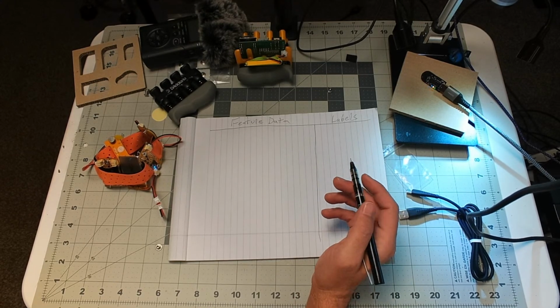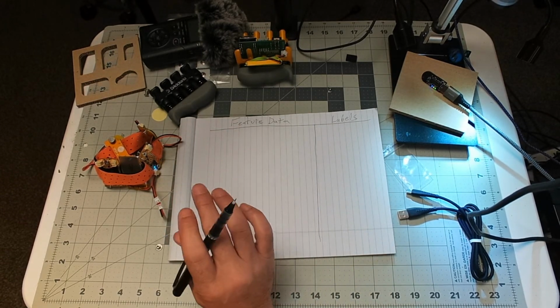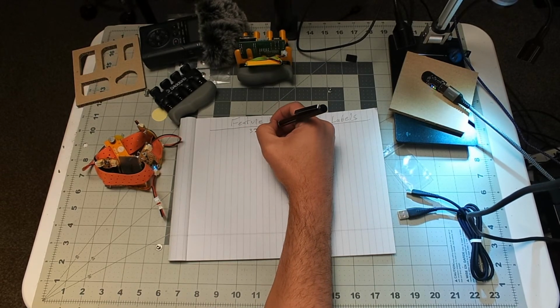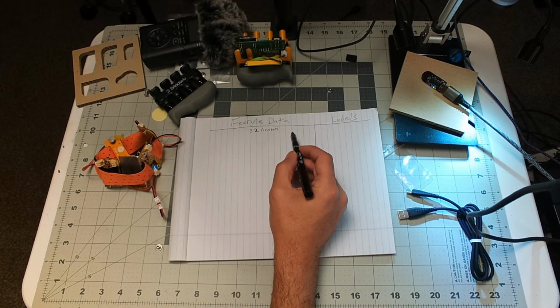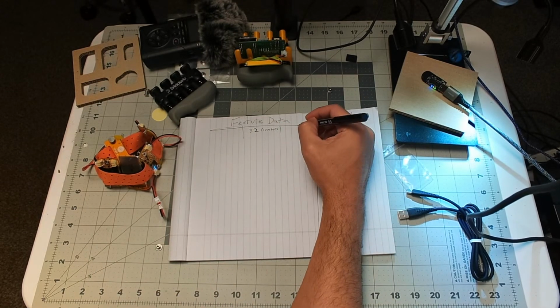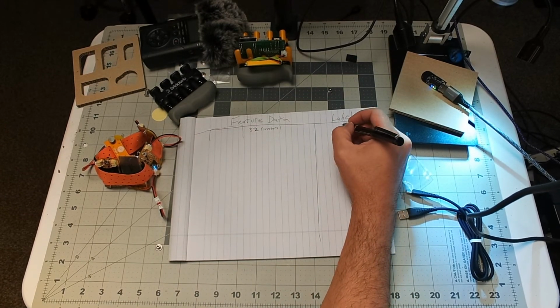So my first inclination is to give it straight up the raw files, in which case it would be 32 numbers. So there'd be 32 columns, and 8 of them would be grouped together, right? But we won't tell the machine learning that. We don't need to. So there'd be 4 groups of 8. I didn't cut this evenly. And then there's just going to be 4 numbers here.